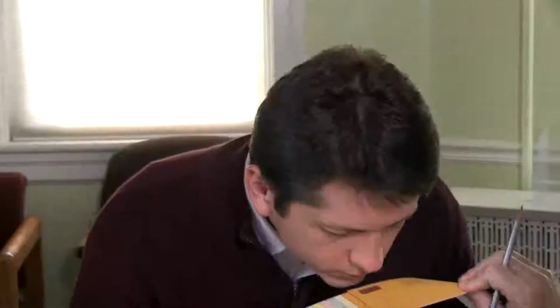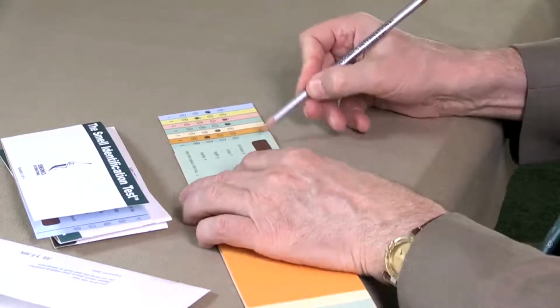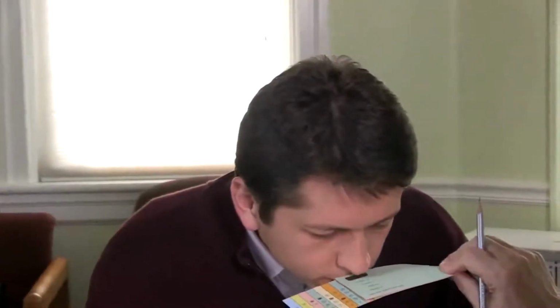This one smells most like skunk, mint, fruit punch, or cola. Right. Mint. Mint. Now, we're using the North American version of this test, which has response items like skunk, which aren't known throughout the world. There are 14, if I remember correctly, different language versions of this test. Some of the items have been changed slightly, both in terms of the odors and the responses, but it's essentially the same. It smells like banana, garlic, cherry, or motor oil. Banana.